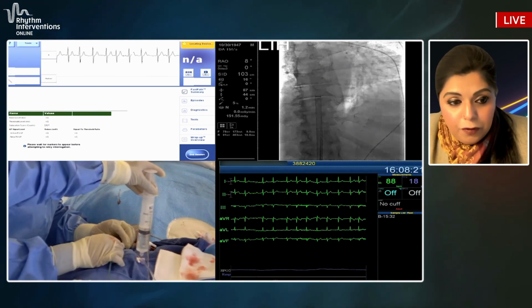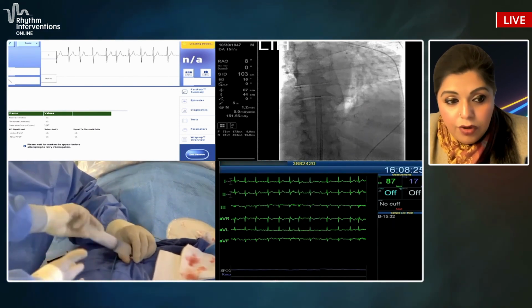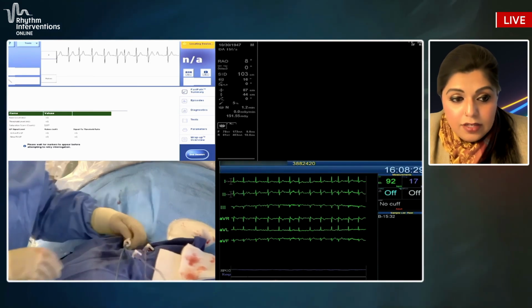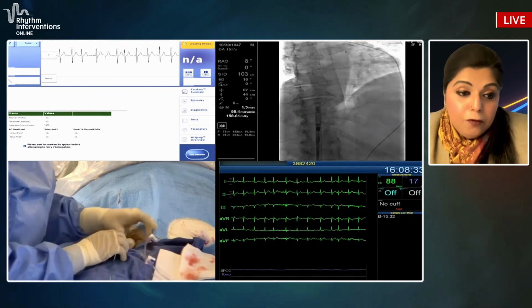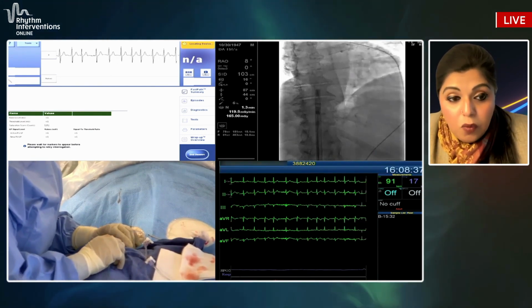And you don't have to fluoro for the first certain part of that entry until the second blue-gray marker. So the sheath comes in two lengths. There's a 30 and a 50 centimeter length. This is a 50 centimeter sheath, so you can go up to the second marker. For a shorter patient, you can obviously use a 30 centimeter sheath if you wanted to.